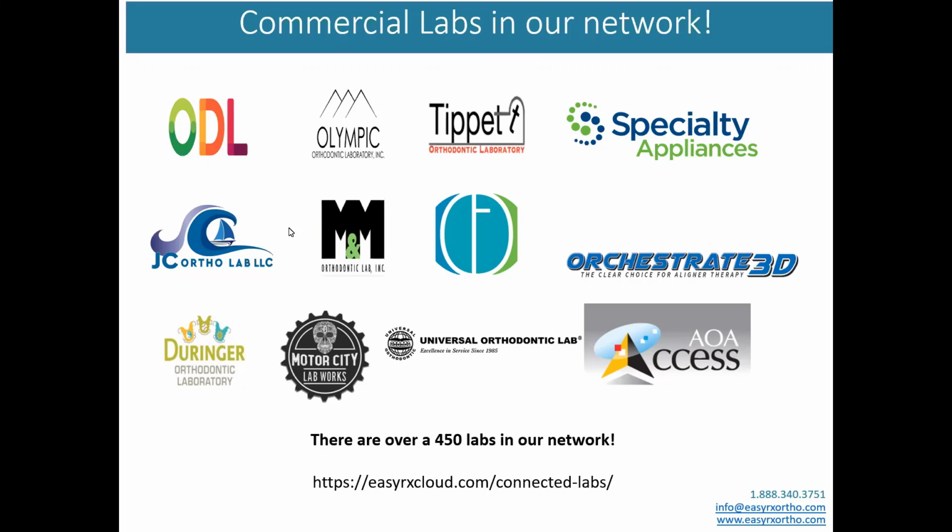If you get into using EasyRx and you find that we maybe don't have one of the labs that's in your network, we can hook them up at no cost. So we want you to be able to communicate with any lab.